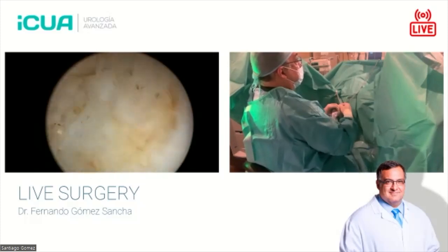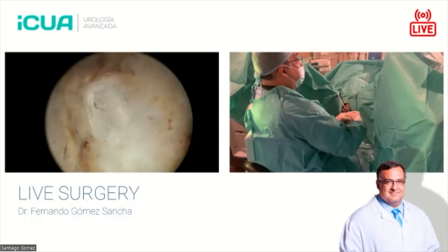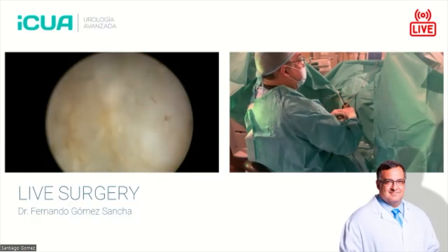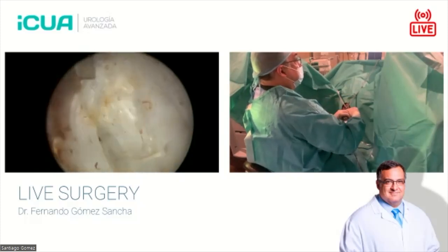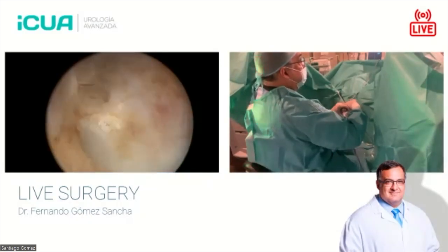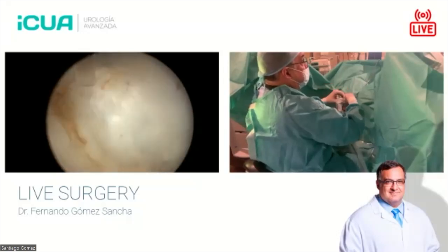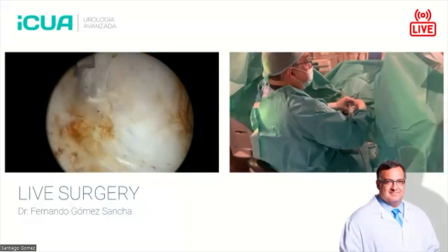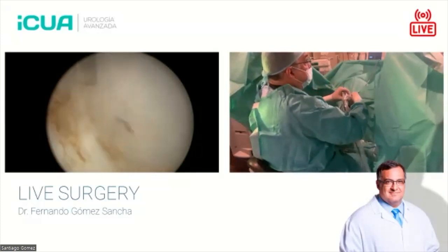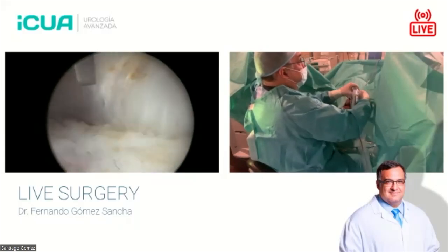Of course, you can develop the plane with a knife. If you think about peeling an orange, we peel oranges with a knife, of course, but many times some of the yellow stuff from the orange skin remains, and some meat remains on the skin, you know what I mean? So the idea is that holmium pulses help you find the right plane due to this explosive effect, whereas thulium has very good cutting properties.